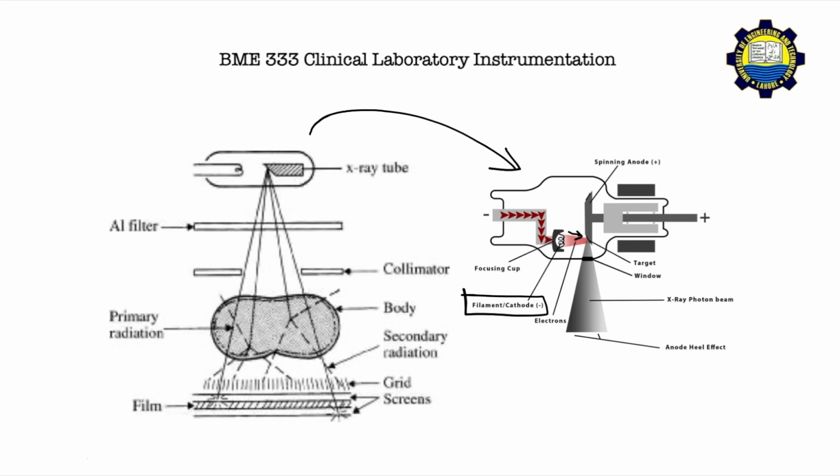The other important thing is the high voltage electric field that has been set up, which obviously allows these electrons in the cathode to accelerate towards the anode. And this acceleration is important because it gives them very high kinetic energy. So if they come with a high kinetic energy and they collide with the anode, they're going to get converted into X-ray photons better, and the high kinetic energy gets converted into X-ray photons as well as heat. So the majority of this is heat, and there's some packets of energy in the form of X-ray photons.